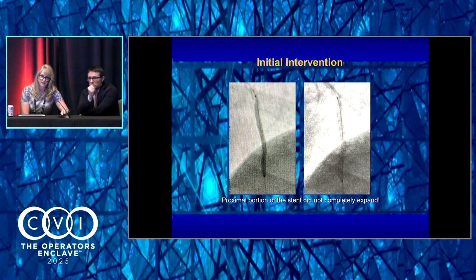So I think if I had just deployed a fresh stent like this and noticed that there was underexpansion of a portion of the stent, obviously the imaging, if you were able to complete it, will have helped you understand what's going on, but I would likely use an OPN balloon, potentially something like shockwave, or even just a scoring balloon, depending on exactly what I'm seeing on the intracoronary imaging.